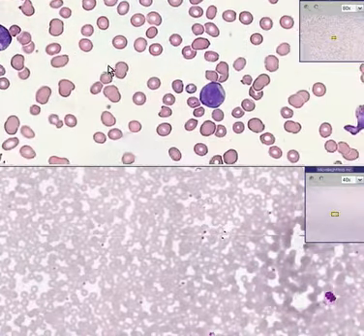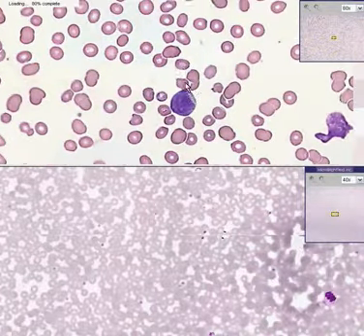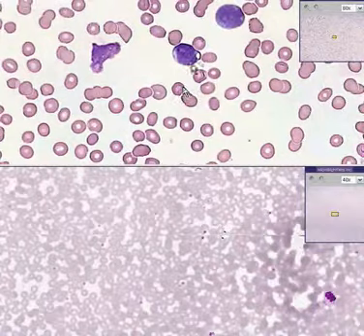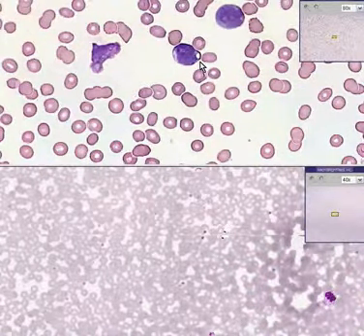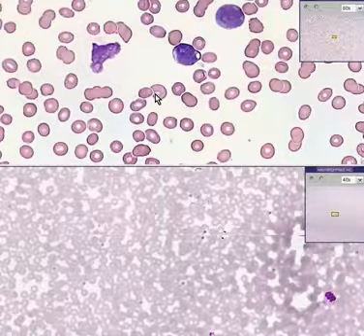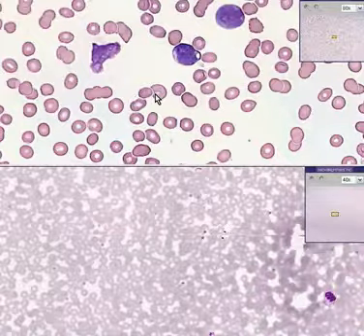their cytoplasm. Here's one with very minimal and undifferentiated cytoplasm and 2 nucleoli. Here's one with 1 nice nucleolus. Here's one with a couple and very minimal cytoplasm. These are blast cells. Normally, the number of blasts you should have in a peripheral smear is about 0%. Whenever you have more than 1 or 2, or in this case, it looks like 90% of them are blasts, you can diagnose acute leukemia.